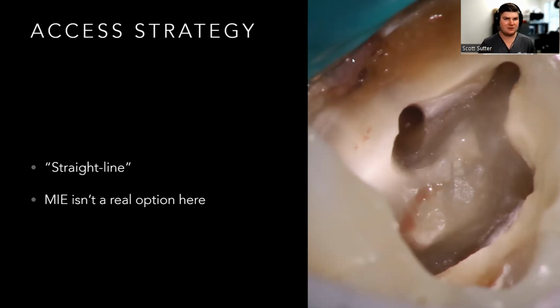For a calcified tooth, unless you're using some guided things, which are pretty cool, you're going to have to make a larger hole. In this case, the caries did it for me. So this obviously is not minimally invasive. I mean, a lot of people would say the canals were, but the access wasn't because the bacteria did it for me. And so that made it a little bit easier.